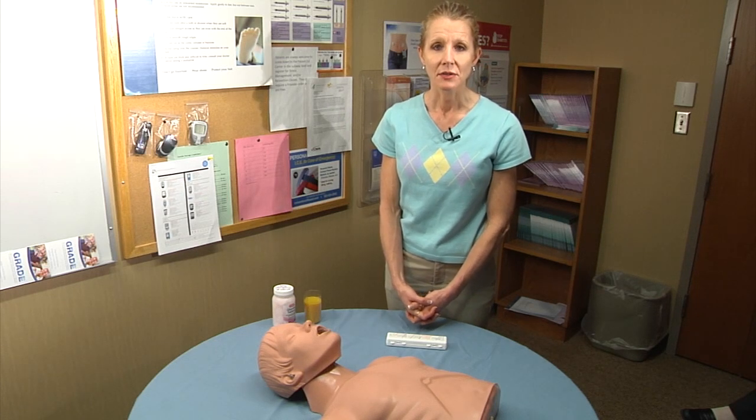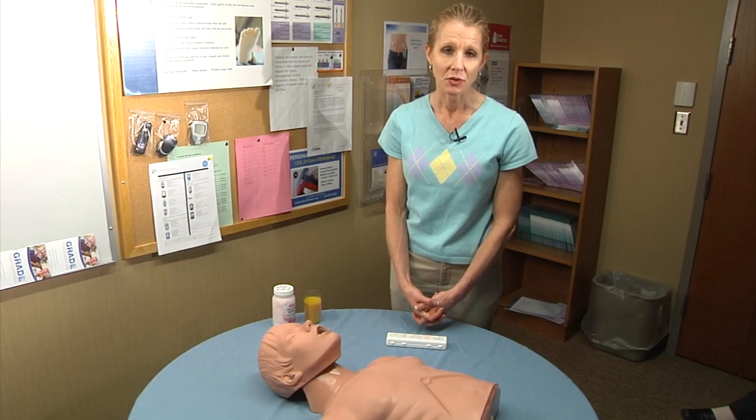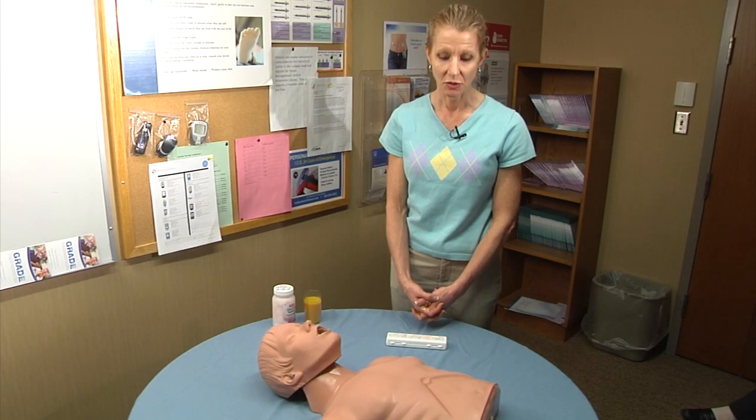My name is Sarah. I'm a certified diabetes educator. I'm here today to demonstrate how to use a glucagon emergency kit.